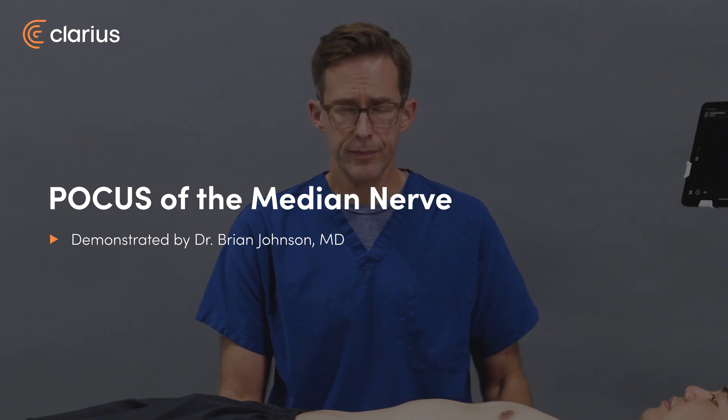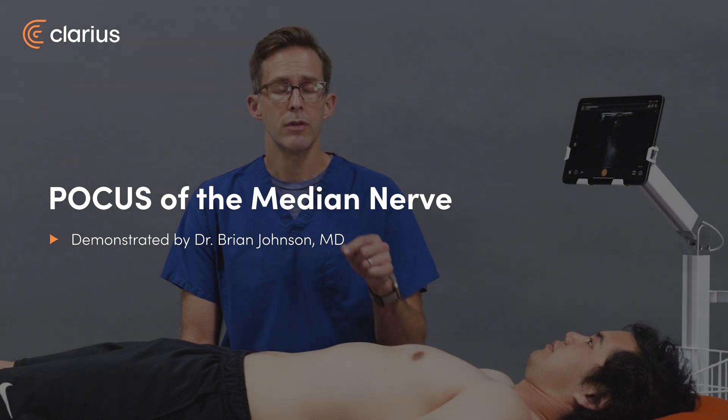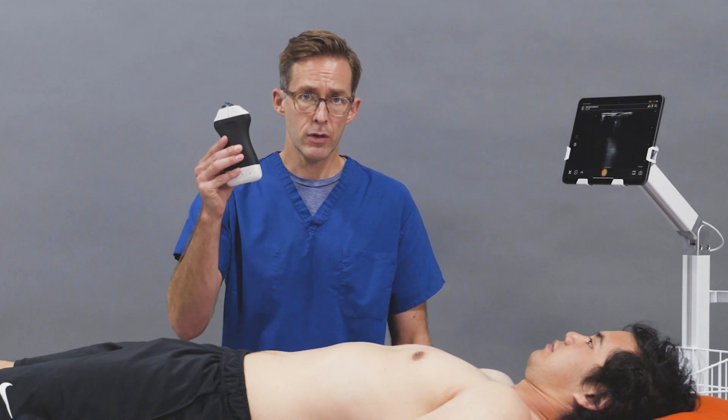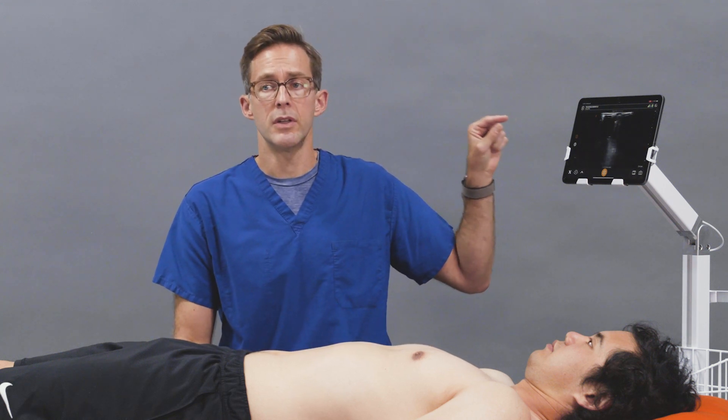Hello, I'm Brian Johnson, and today we're going to use the Clarius Pal to identify the median nerve for a median nerve block. You have your Clarius Pal, and on the Clarius app, you want to be on the nerve setting, which has already been set for us.